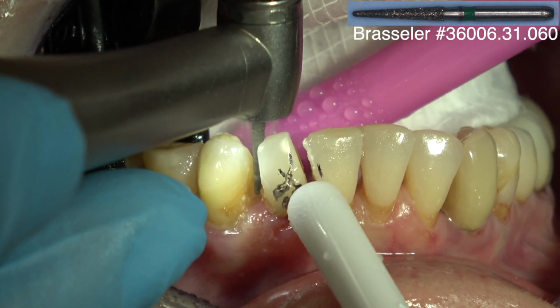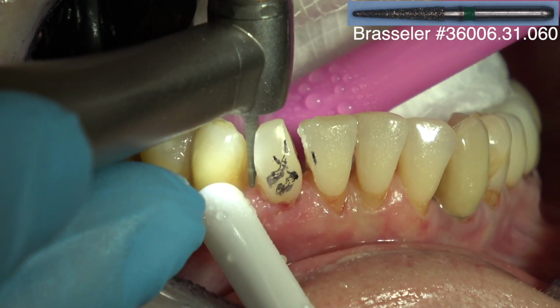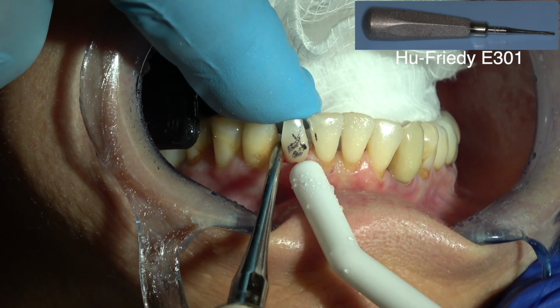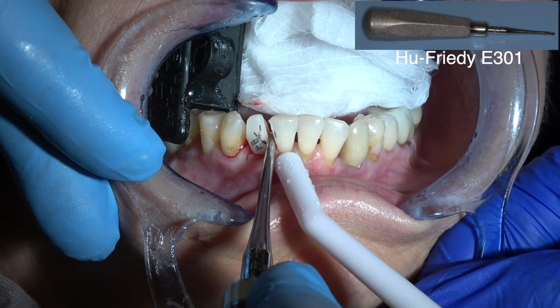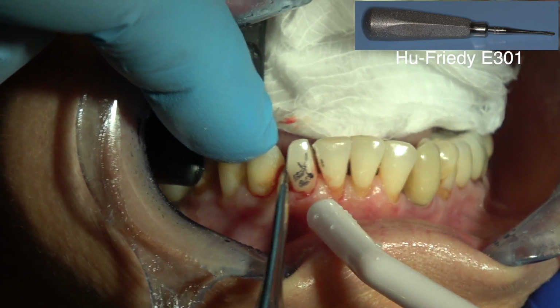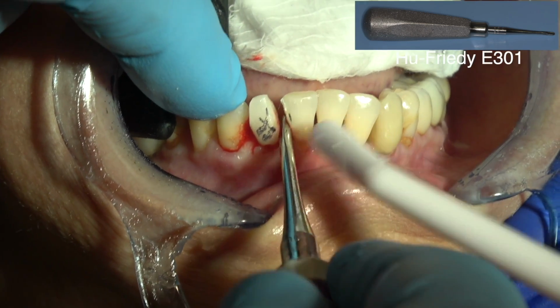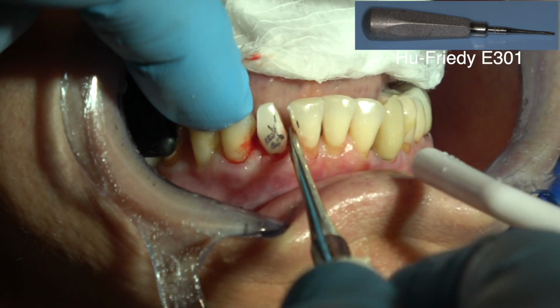We're trying to preserve the facial bone, which did not work out in this case. I'll show you here in a minute, but we're trying to preserve it. And if you could take the tooth straight out of the socket, I could probably place the implant at the time of extraction. So you can see we're moving the tooth, but I'm thinking it's probably going to fracture at the line of the internal resorption. I've got pretty good movement.